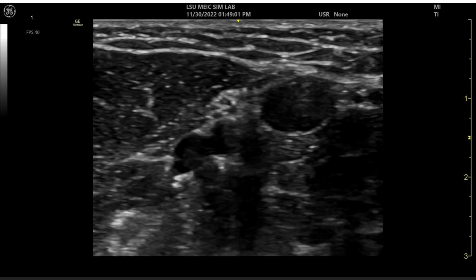When we're preparing to kind of put all this stuff together, we actually were scanning each other and noting some of the anatomic variability between different providers, and you'll see this in patients as well. So we've got another transverse view of the upper arm, so probe marker towards patient's right, soft tissues, got our biceps muscle, so then we have to go through our same stepwise process. Got this structure, if I run up and down it, you may have shifting and honeycombing, so that's our median nerve. Go below it, this isn't live, but most likely brachial artery. Then we've got some edge artifact from this structure above it.